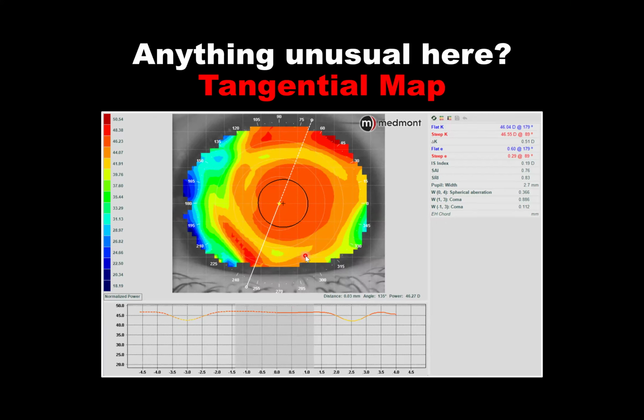Entonces vemos en este caso, este es exactamente el mismo ojo, la diferencia es que aquel era mapa axial, este mapa tangencial, y el mapa tangencial nos deja ver, como pueden ver ahí en el área amarilla, que definitivamente algo que está sucediendo es demasiado simétrico para ser algo al azar. Algo está pasando. Estamos pensando en moldeo que un lente de contacto puede crear en esa superficie ocular, en este caso obviamente la córnea, ¿verdad?